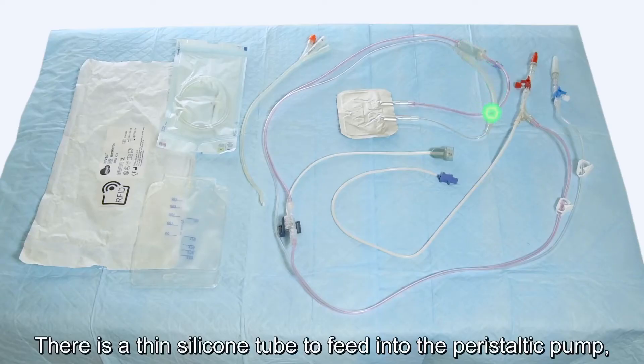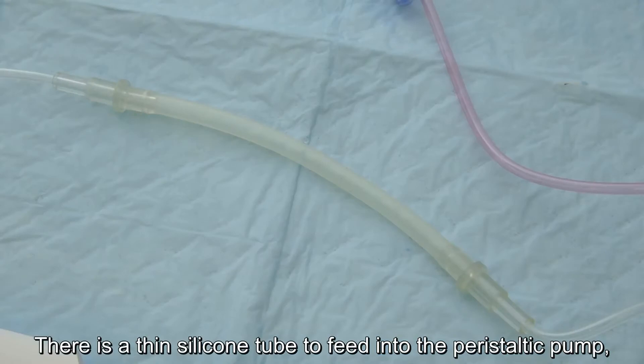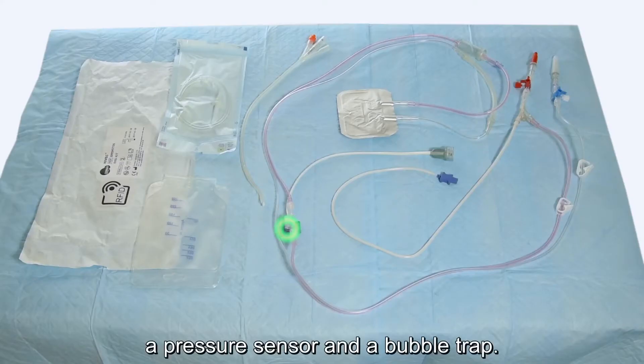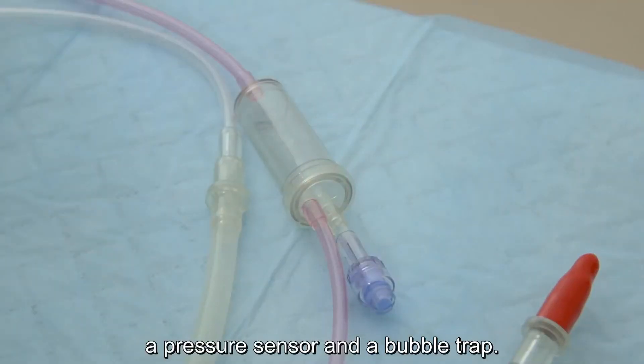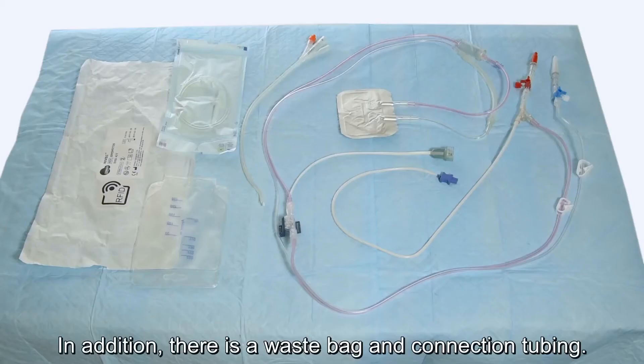There is a thin silicon tube to feed into the peristaltic pump, a pressure sensor and a bubble trap. In addition there is a waste bag and connection tubing.